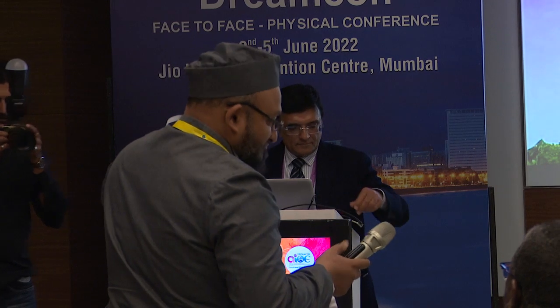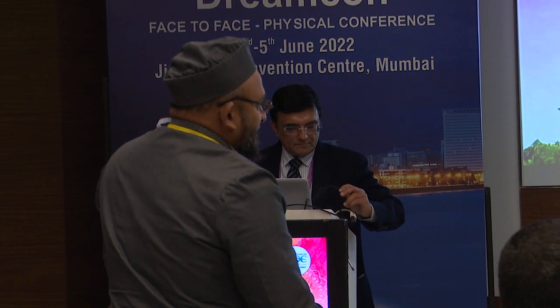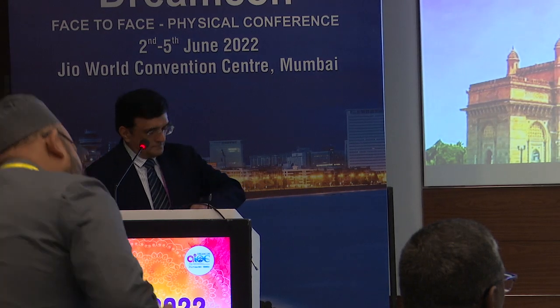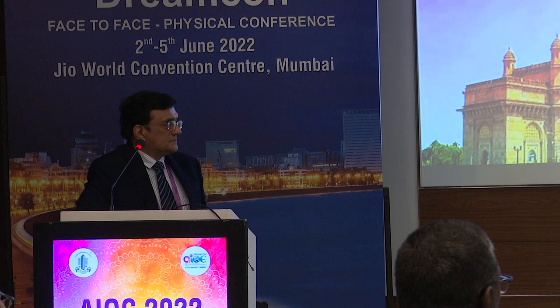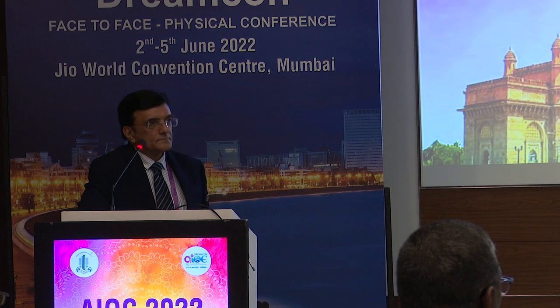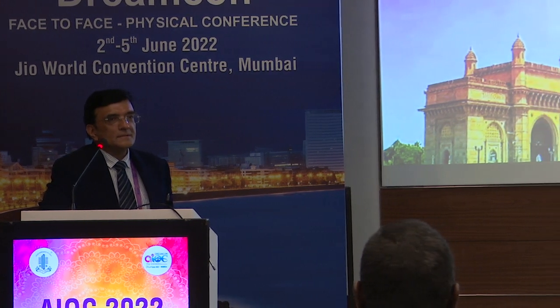So you're talking now about diabetic vitrectomies and bleeding. I think I will be speaking on that. Probably we'll have the discussion after that on this topic. I'll be discussing all these important points. So now I think we can just focus on Dr. Ajay's presentation, which was about the occurrence of a submacular hemorrhage during vitrectomy, during an uncomplicated surgery. This I'll discuss in detail.